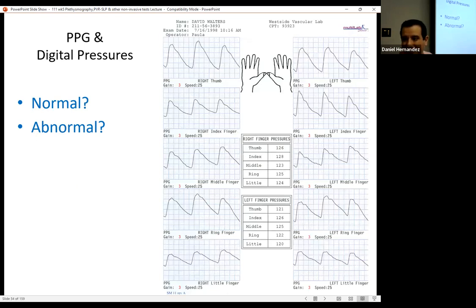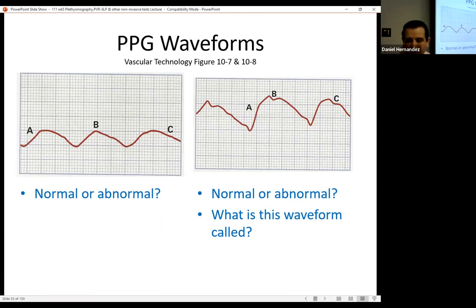Wait, okay, so you're saying obstructed, like the pulse contour, I'm just going off that chart, so obstructed is Raynaud's phenomenon? Yeah, so Raynaud's phenomenon has an obstructive component as well.